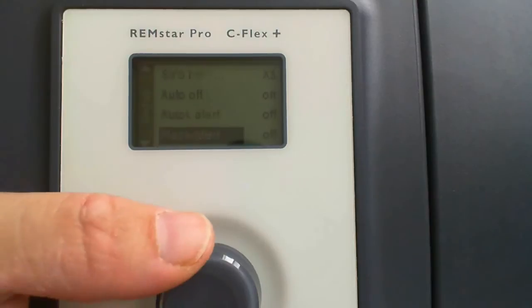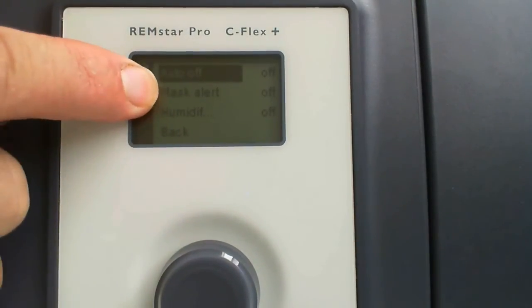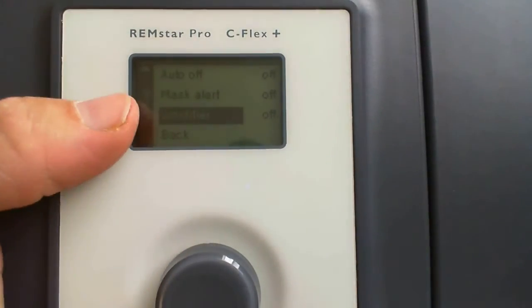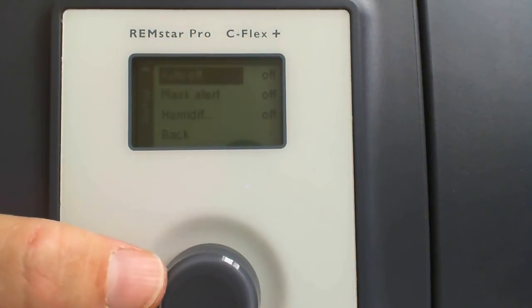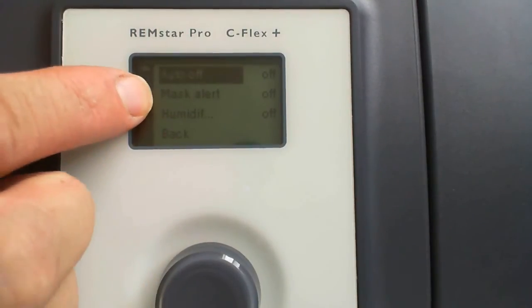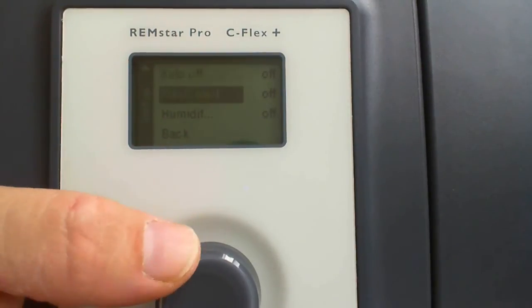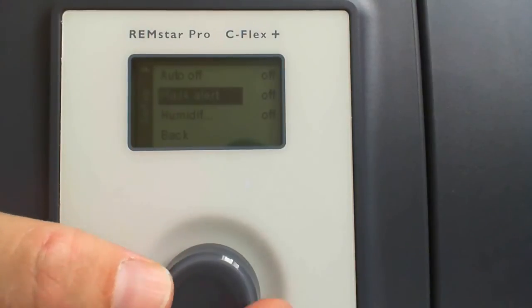So the next one here is mask alert. Now I have this shut off. I found that the alarm isn't enough for me to actually hear, because Pappy wears earplugs to bed. It's like a wristwatch alarm: when the mask alert senses a large leak, it goes off. It leaves the machine running, but it sounds an audible alarm, hopefully to wake you up. Well, for Pappy, it's not going to do it.